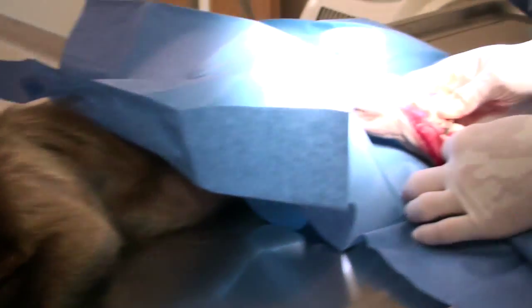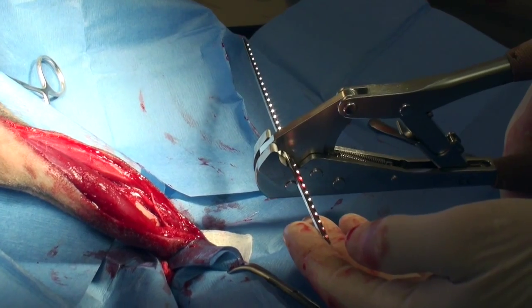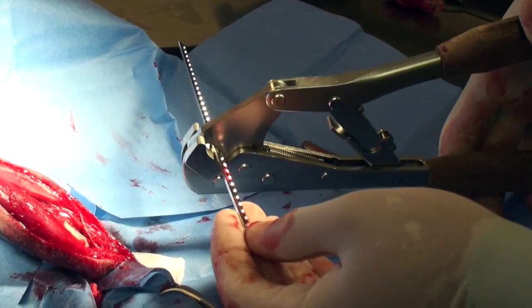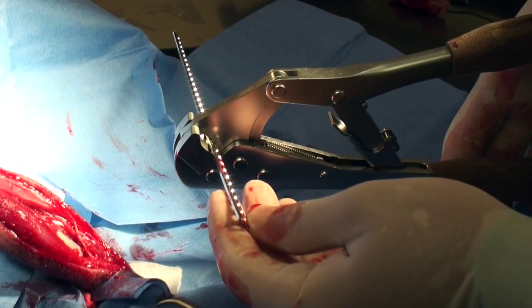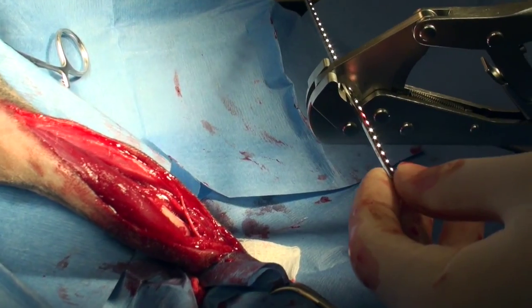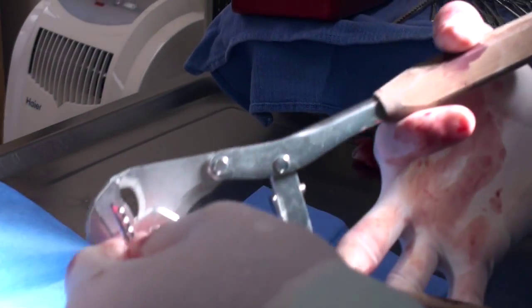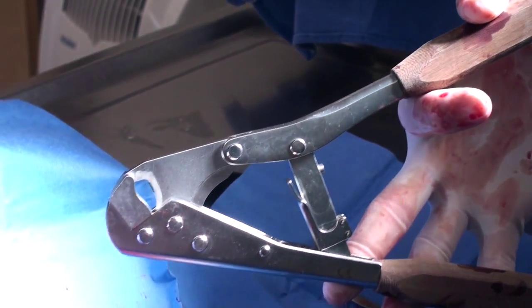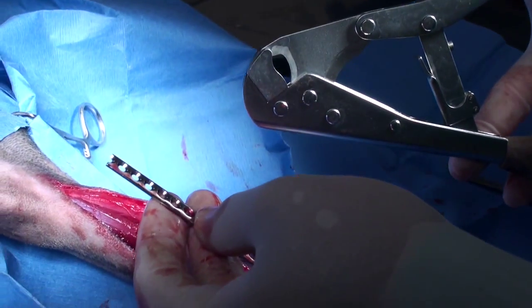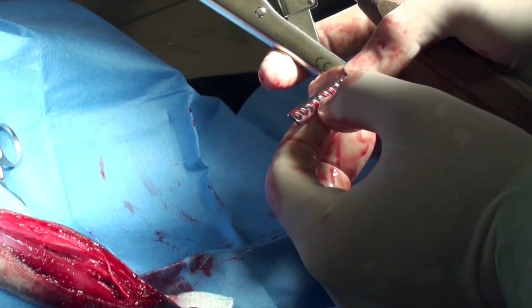Now we'll have to choose the plate size and keep going. We're using a cuttable plate. I measure the amount of holes and the minimum amount that we need to get in the distal portion, so I'm cutting right here. We measured the plate and it's going to be nine holes.